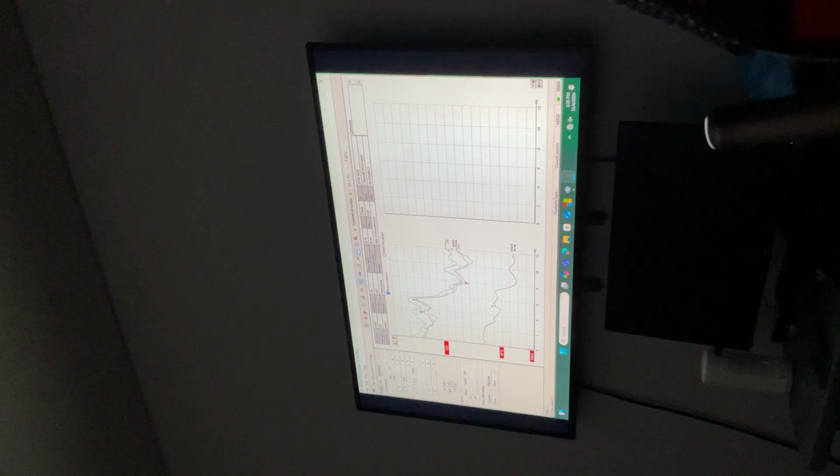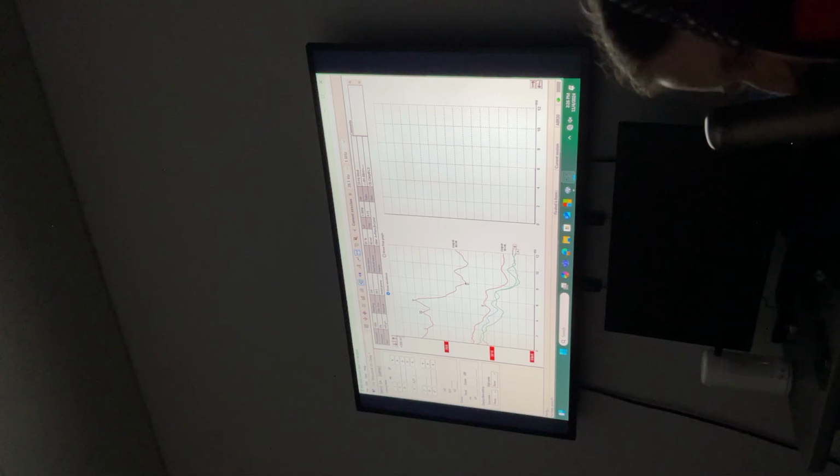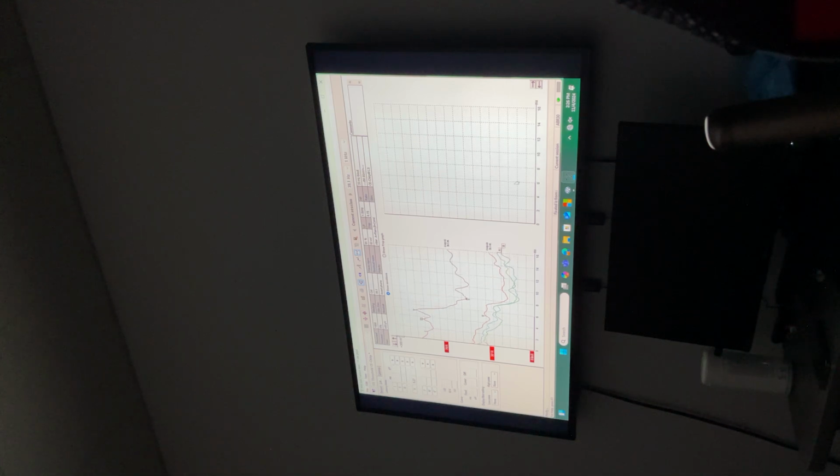If we didn't mark that, will we get marked down on our report? No. So we went from 70 to 30, do you see a wave 5? Do you see a response? Yeah. Where? Right before 8. Oh, 7, right? What about Christine, do you agree? Yes, I do agree.